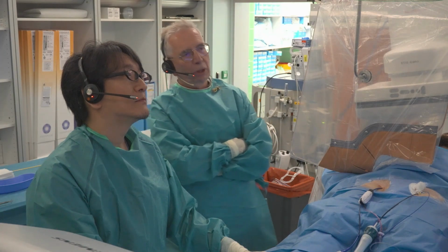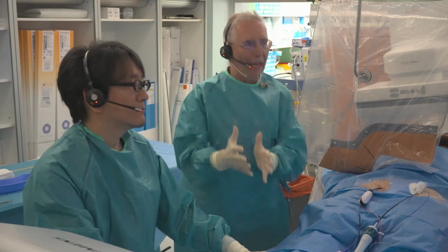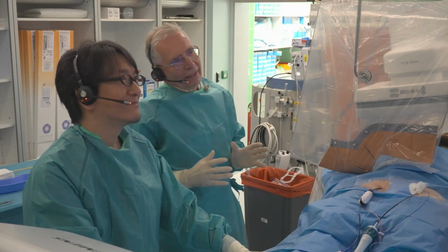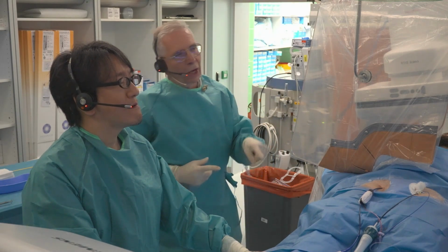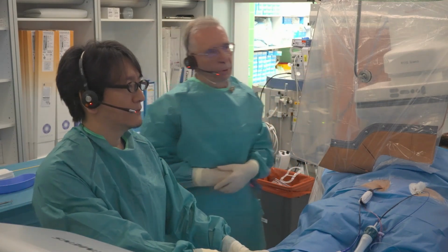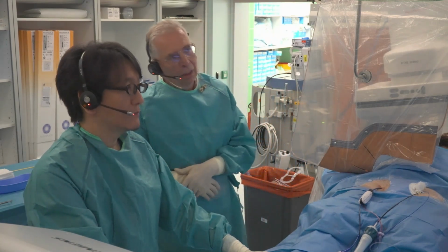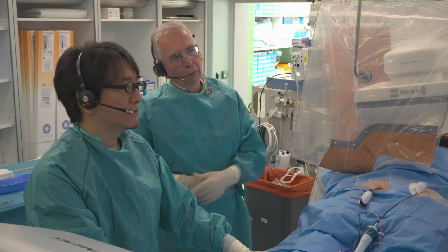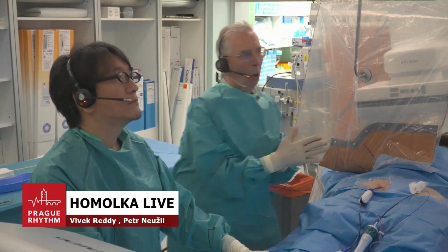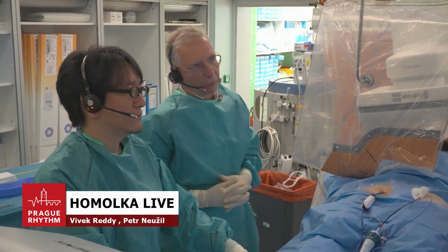The question about the posterior wall. Why are we doing this pulsed field posterior wall? Because we can. It's safe. And actually, until now, maybe for sure. The MANIFEST registry showed, when comparing the posterior wall and recurrences, that the MANIFEST PFA trial didn't show a bonus from the posterior wall. But with PFA we need to consider who did the posterior wall, in which way, and how the posterior wall application is controlled.